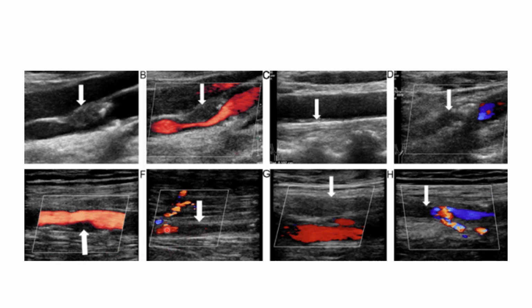This is showing color. It's showing a B mode image in the center here. You're not getting any color flow through that B mode. So in that case, you'd want to increase your color gain. You'd want to decrease your color scale. You might even want to change to power Doppler to ensure that there is something there. This is really not echogenic like a lot of plaques might be. So this could be indicative of maybe a thrombus that is going to be a little bit more subtle.